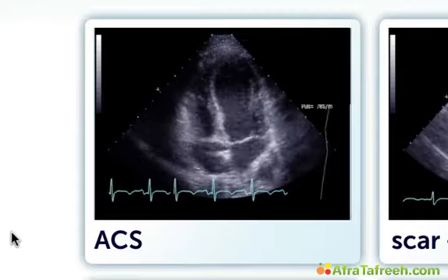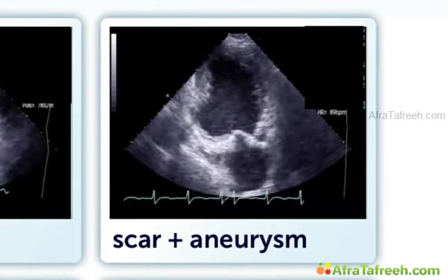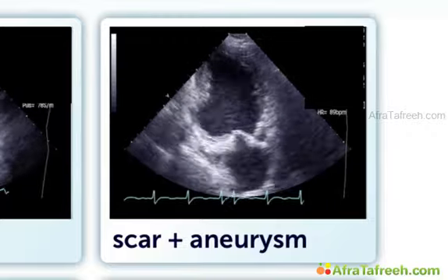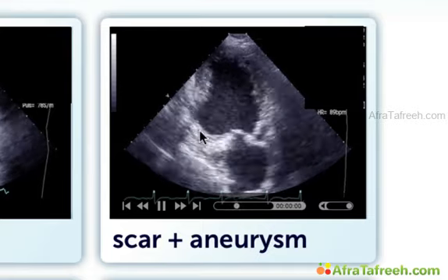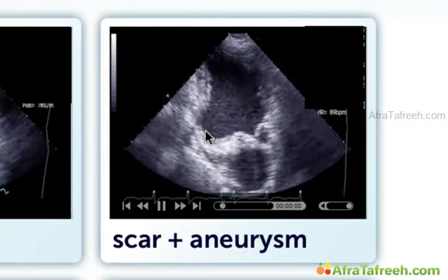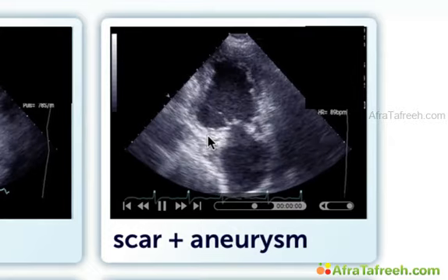was adequately treated. Here we have a patient who had a myocardial infarction many years ago and where we know that the right coronary artery is occluded. Now, we can certainly not expect that reperfusion will bring about a normal contractile function of the segment simply because it's a scar. It's thin, it's echogenic, and it is also aneurysmatic.